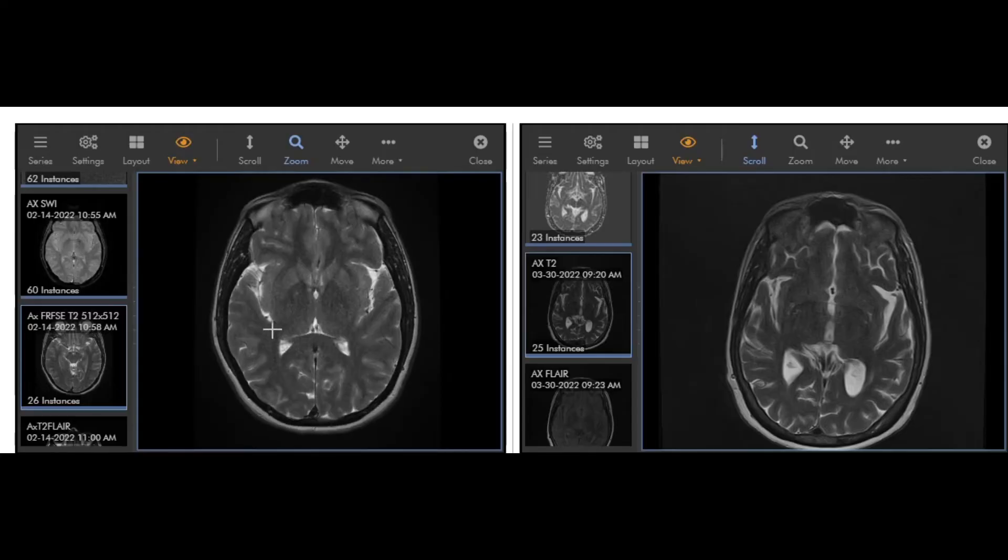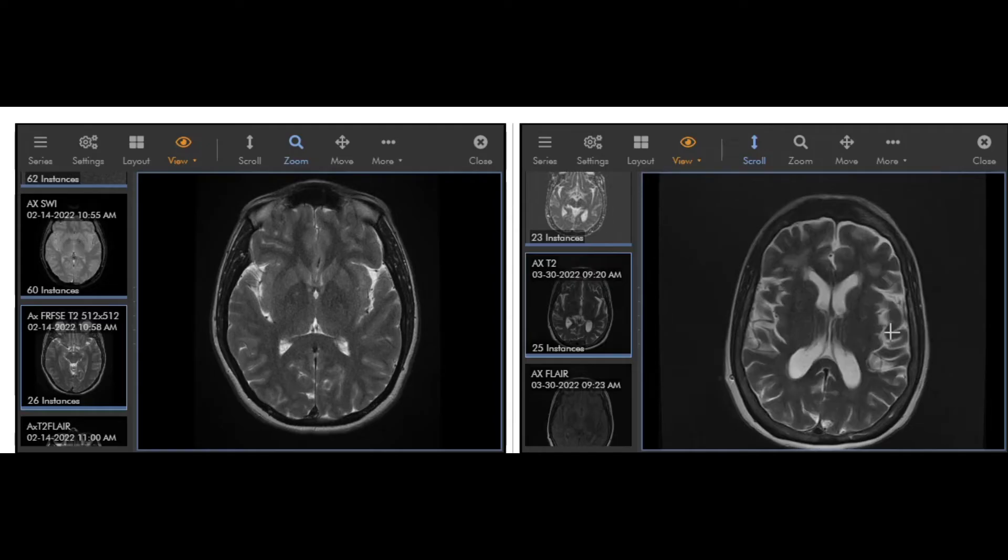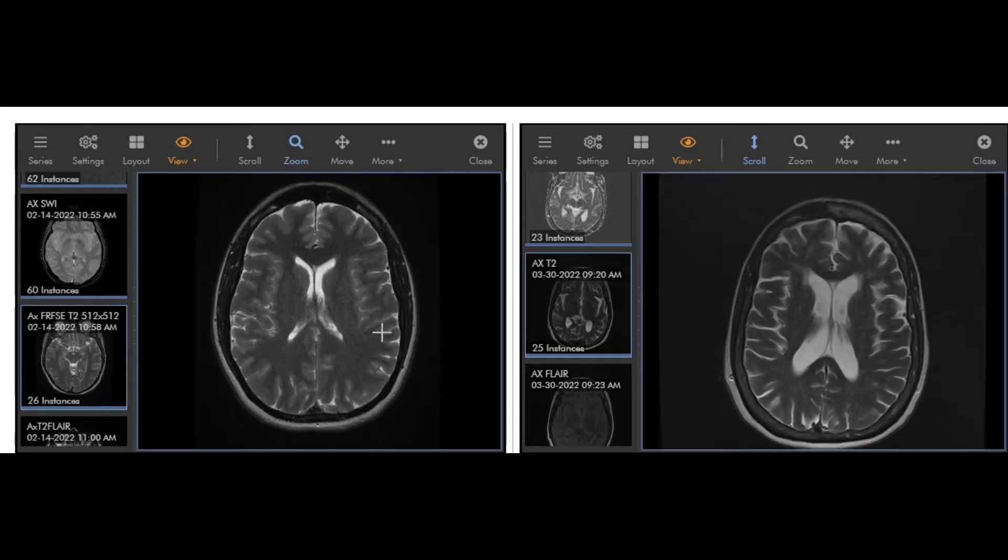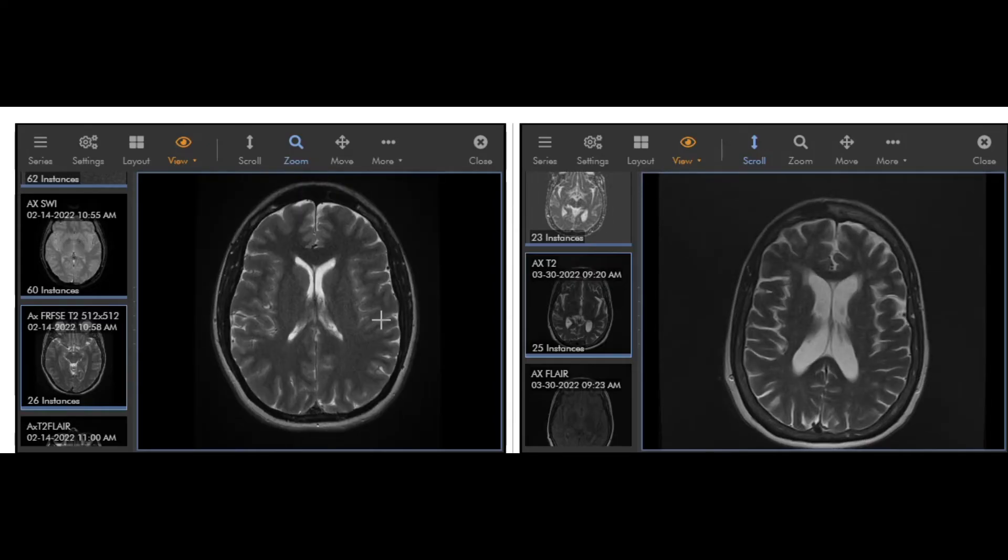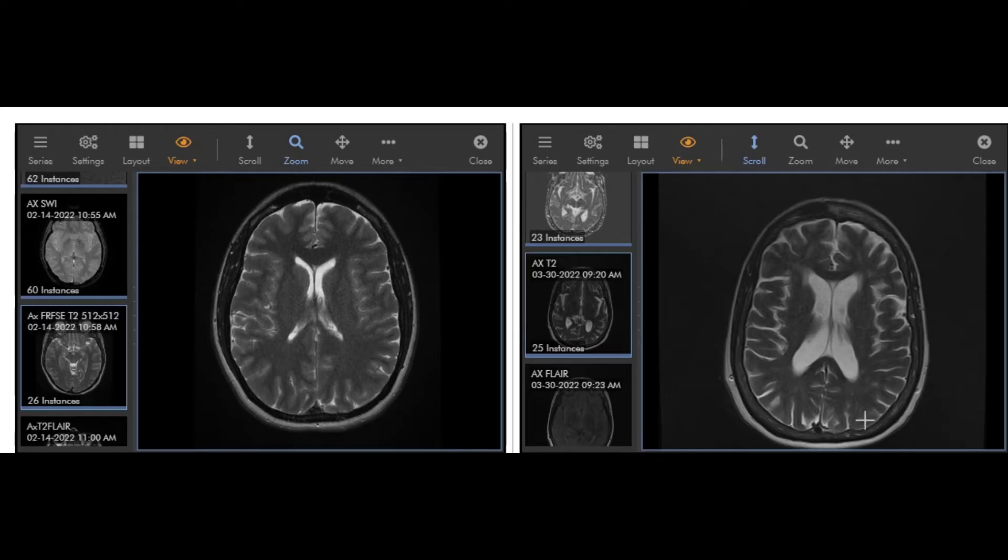So anyway, so you can see on this one, there's a little bit more of the white fluid. And so as we go up even more, you can see also these gyri here of the cortex, that's what these sort of finger-like projections are called. They're kind of touching each other, there's not a lot of white in between them. Those are the sulci. And you can see here, we can see those sulci a little bit better. So this is a brain that has some mild atrophy.